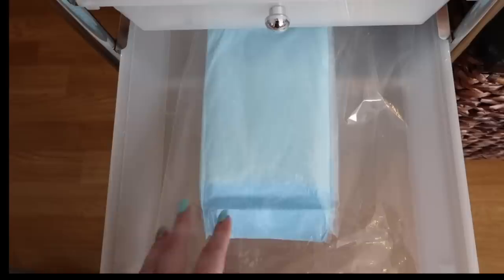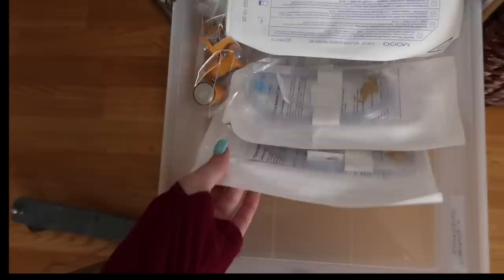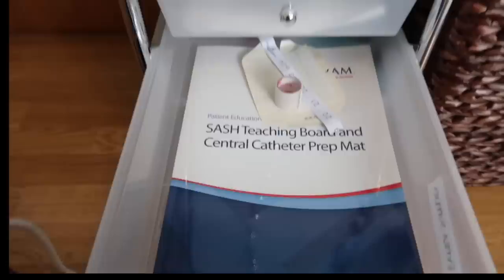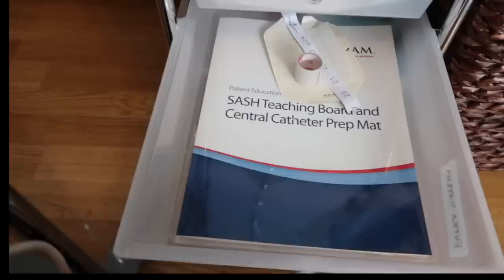I have sterile saline, then dressings and dressing change kits. These are blue pads — we put them down on the table and work everything off of them. They're not sterile but we still set up our sterile field on top of them. Then I have the tubing for my IV — this is the tubing that goes in the pump and runs down and connects to the end of my line. So IV tubing.